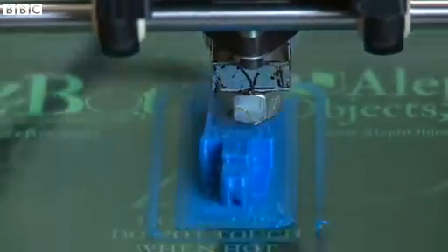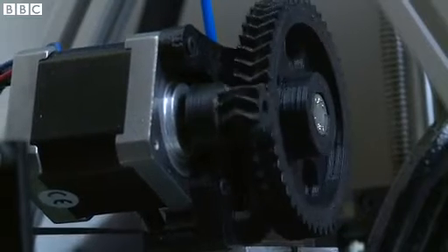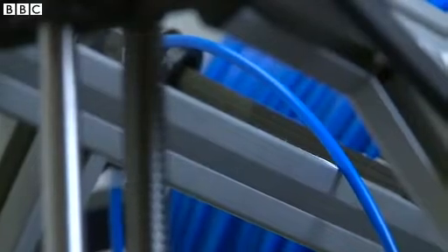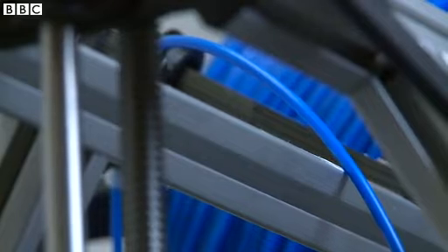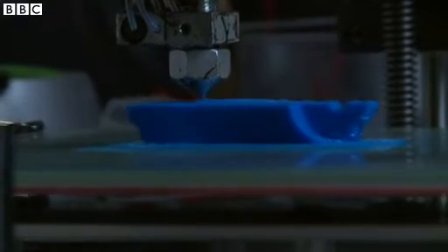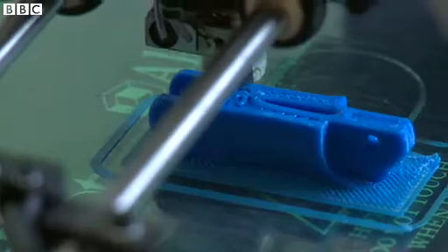None of this would be possible without 3D printing because prototyping in plastic like this would cost a lot. Every single time you want to get a new part made you'd have to send off for it, wait for it to be delivered, and pay a premium for all of that service. With a 3D printer I could come up with an idea, model it on the computer, print it and test it, all within the space of around two hours.